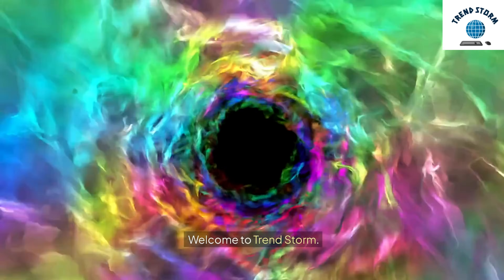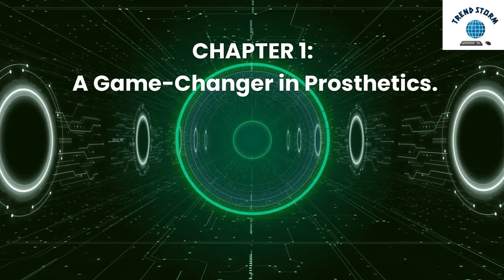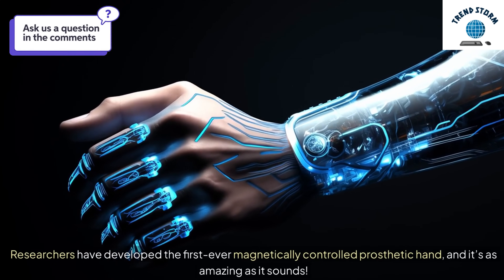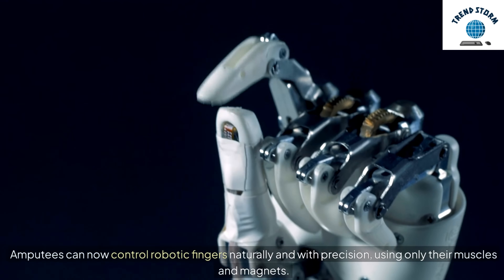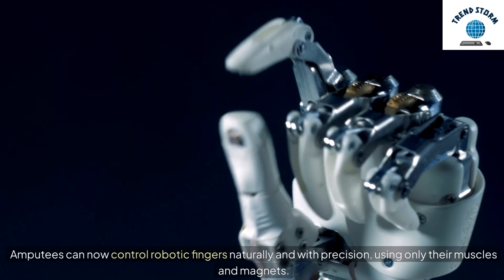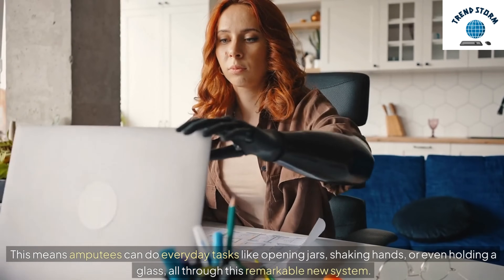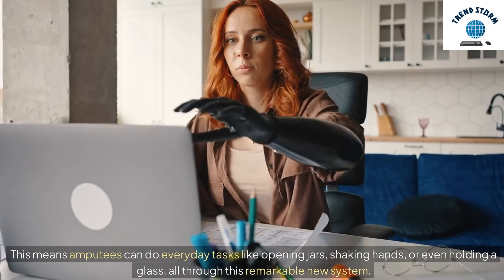Welcome to TrendStorm. Researchers have developed the first-ever magnetically controlled prosthetic hand, and it's as amazing as it sounds. Amputees can now control robotic fingers naturally and with precision, using only their muscles and magnets — no wires, no complex setups, just thought-powered movement. This means amputees can do everyday tasks like opening jars, shaking hands, or even holding a glass, all through this remarkable new system.